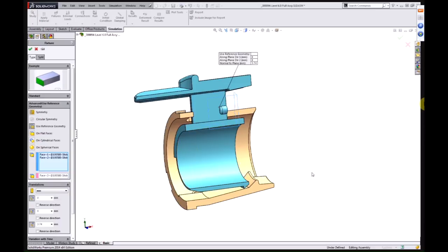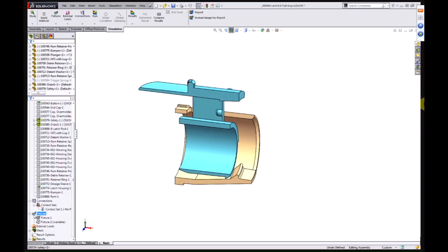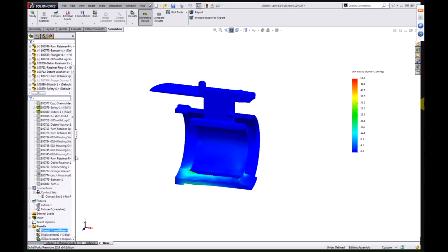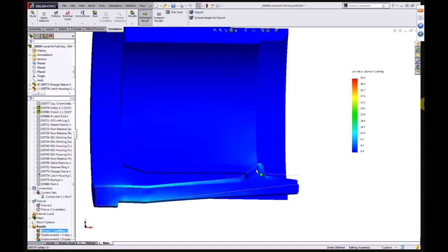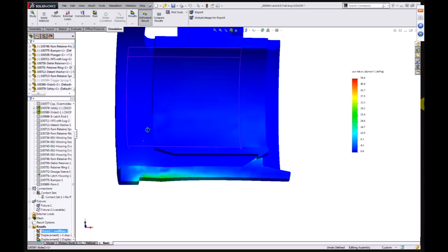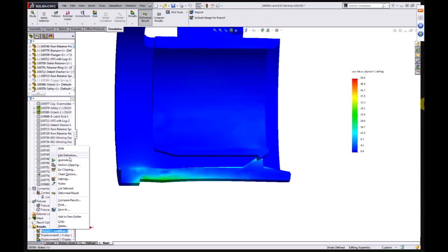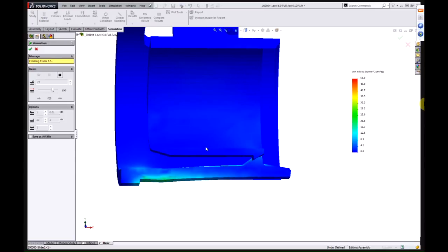It's a nonlinear analysis. So when you do a nonlinear analysis, it solves a series of iterative steps to progress through the loading profile. And we can actually dial up each one of these steps as an individual view. So we can see stress levels as it just starts to engage on the clip there. We can look at stress levels as it maybe reaches the point of maximum deflection, and past. But we can also animate these, and that's often a more interesting way to view it. Or we can look at numerical data versus analysis progress, really rich inputs that we can evaluate here. But in this particular case, it gives us really good insight into the deformation behavior of how this object moves through.